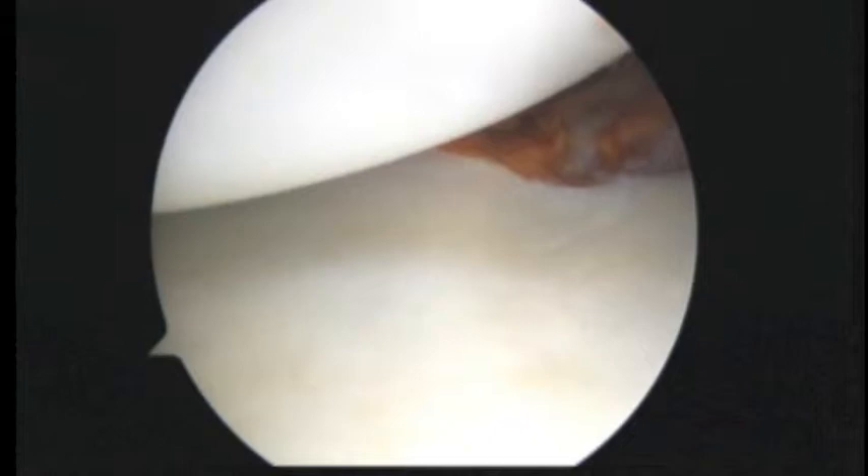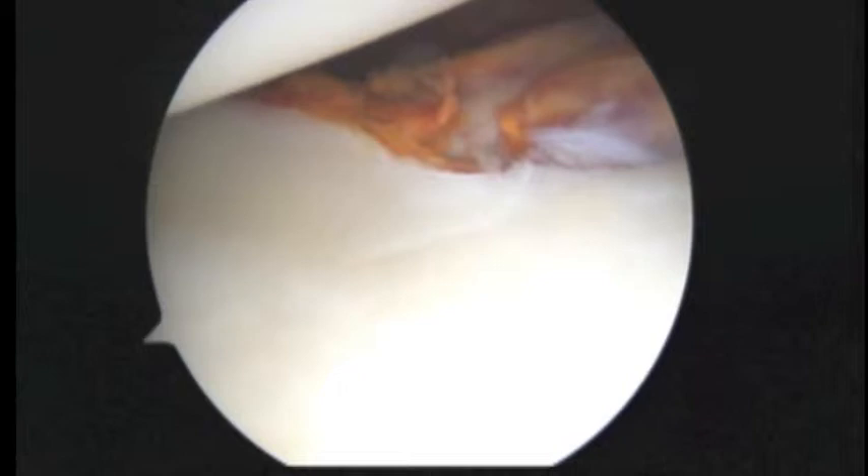I'm going to probe. I haven't seen any bone loss from the glenoid that I can really appreciate. We'll look here and measure this again from the back.